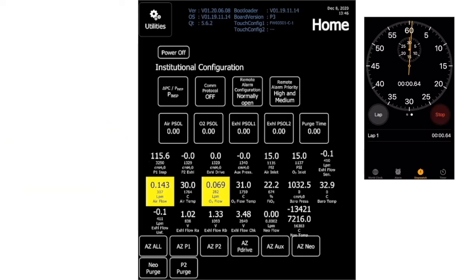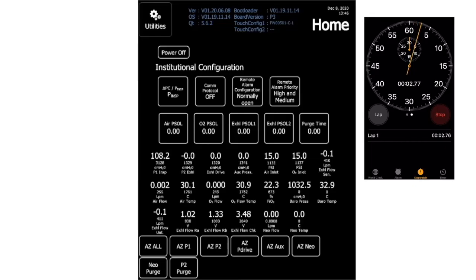So I'm going to start my stopwatch and let's see if it holds. The pressure is dropping. I look at my P1 value. It's still above 90. And even after 10 seconds, my pressure is holding. It's above 90 centimeters of water. So my inspiratory side's nice and tight.